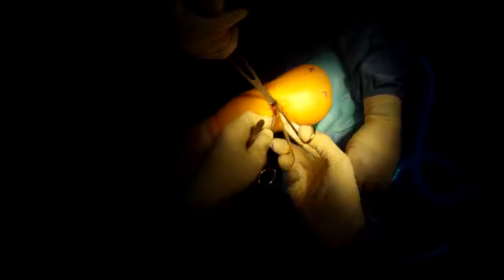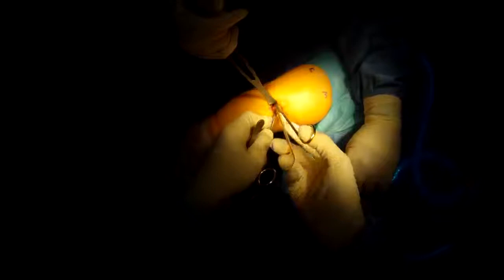I'm just going to cut out the capsule. And there it is. And now we have full flexion of the elbow and the ulnar nerve won't be a problem. All done.